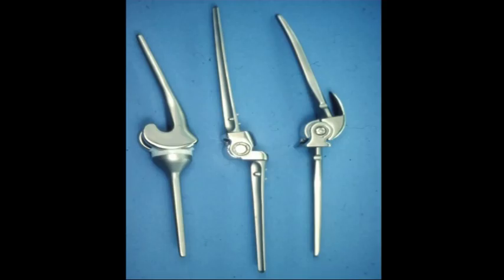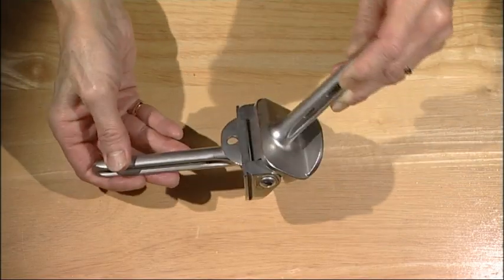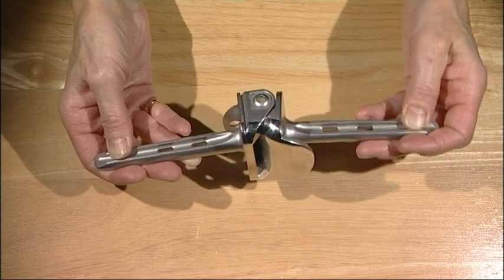The castings were made commercially. They were polished by men in sheds rather than in a laboratory or even in a proper workshop. But they were sterilized at the end, and they were implanted with care and precision, at least as it obtained at that time. The evolution of the current knee replacement is logically traced to the Waldius hinged implant.